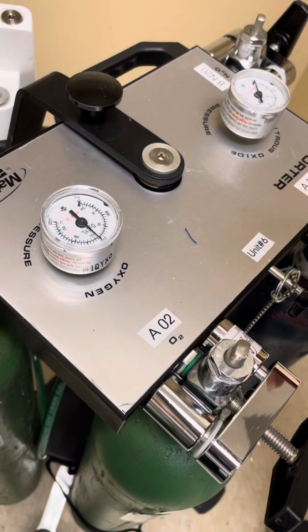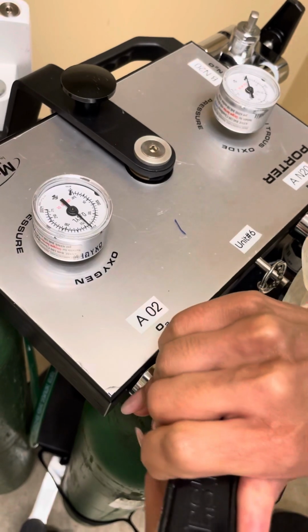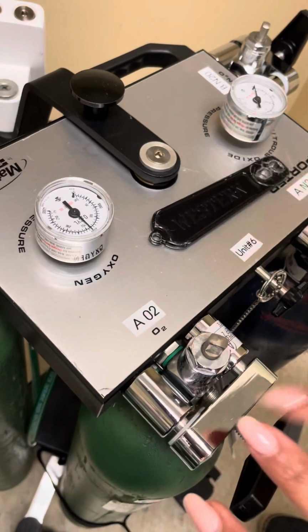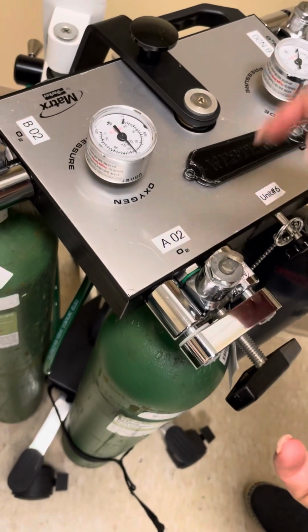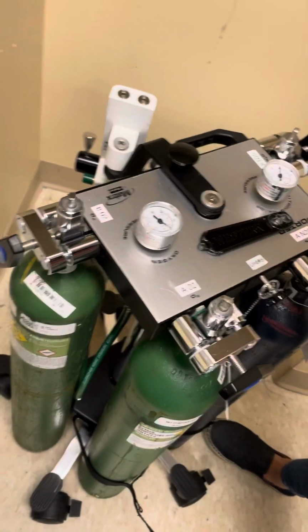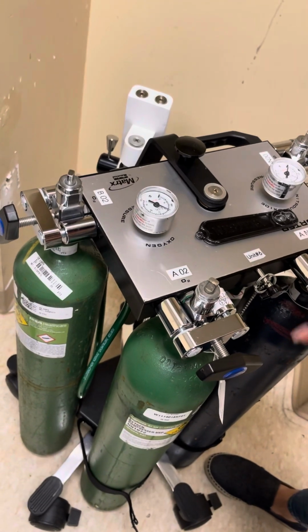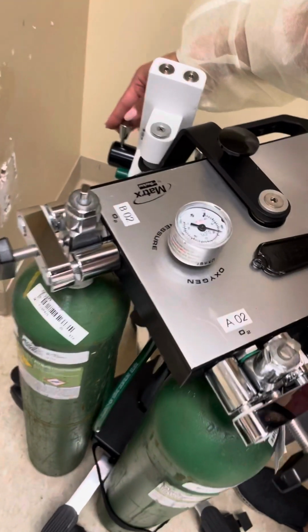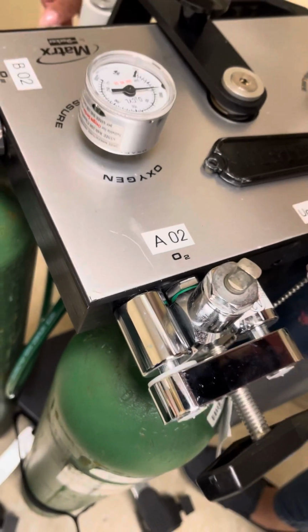Now you can then open it to make sure you don't hear anything. You open the tank, you don't hear any hissing noises. If you hear a hissing noise, that just means that you didn't screw it down tight enough. So you would have to screw it a little tighter, or you're missing a gasket, okay? So one or the other, just make sure that you're not. I just close the tank because I don't hear any hissing, so I know it's on there tight and secure. I'll loosen it a little bit so you guys can hear what it sounds like if it's not secured all the way, just so you have an idea.